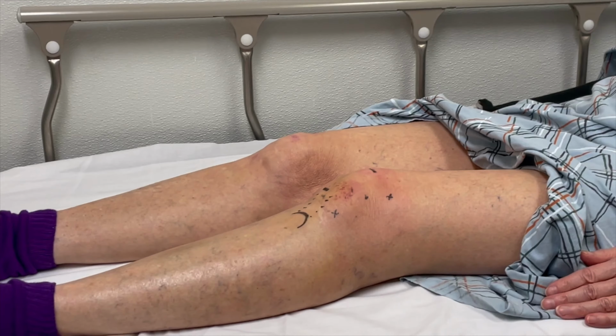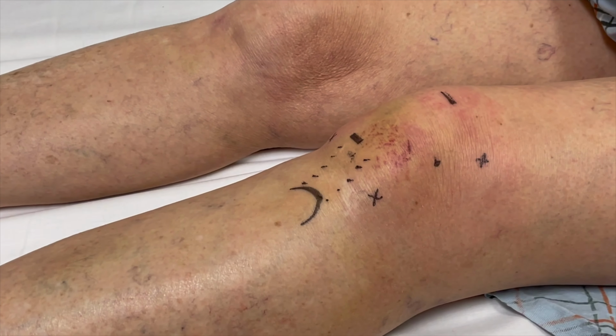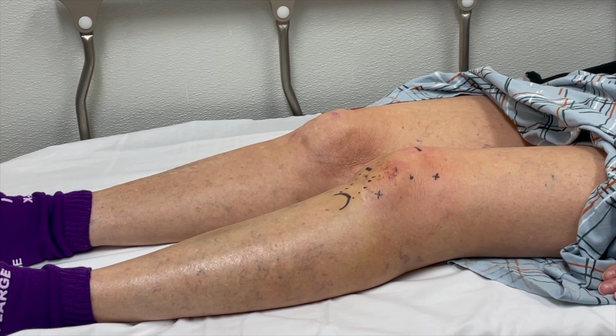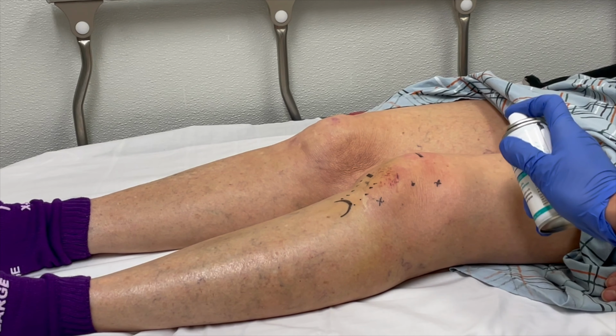Here's a video demonstrating our superolateral aspiration. You can see the patient is positioned supine with a patella facing superiorly to the ceiling, not in external rotation. The sites are appropriately marked as described. Most important is the superior and lateral pole of the patella, and the superolateral portal is marked.